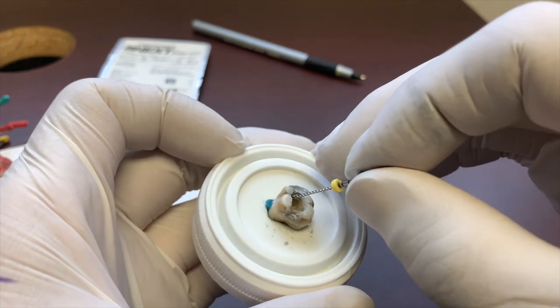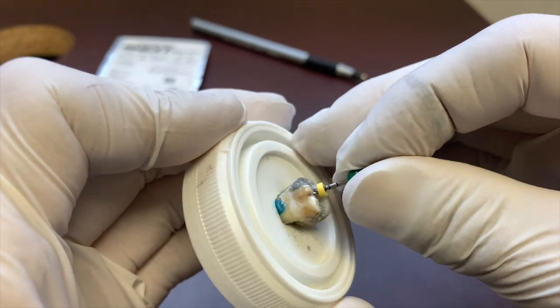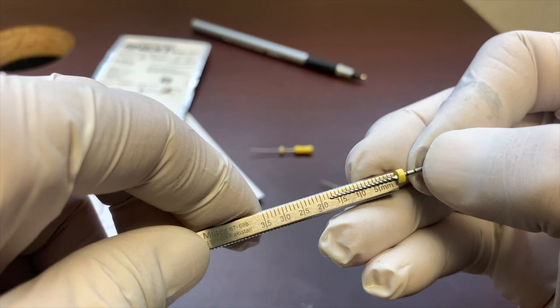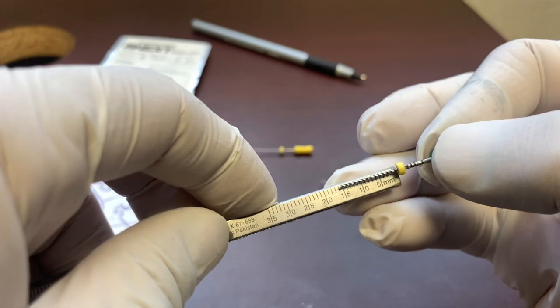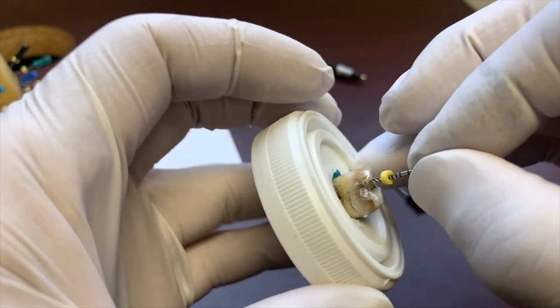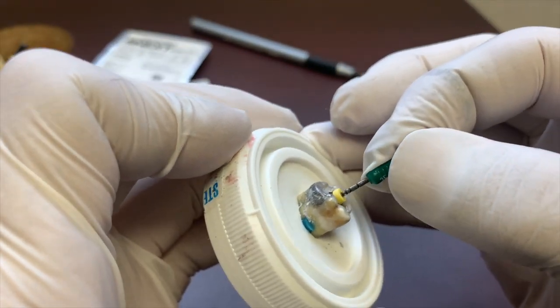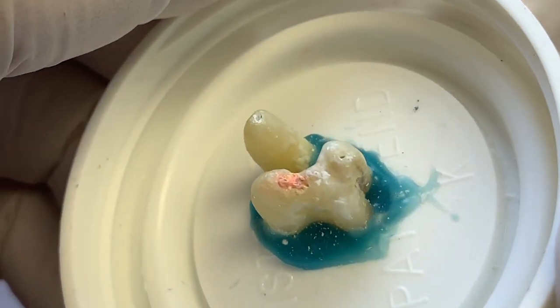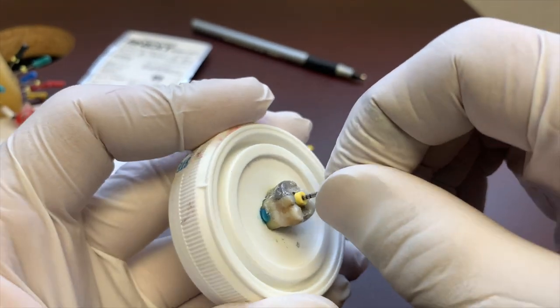I'm going to take my file and place it to our working length, and place it apically. So you can see here, I don't know if I moved that. That's the problem sometimes, I gotta check. So we are at, yeah, we moved it a bit. So that's why, there we go. Let's just check, make sure we're good. Now I'm gonna place apical pressure and see if it moves, and it's moved just a quarter, which I'm okay with. Let's take a look here. Looks like we're good. So now we've created an apical preparation.